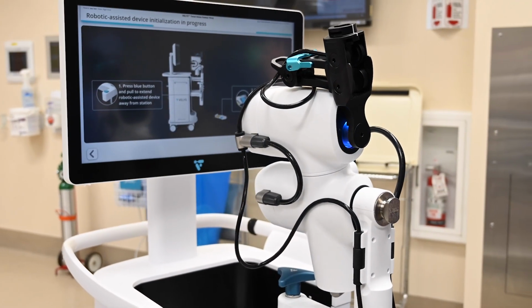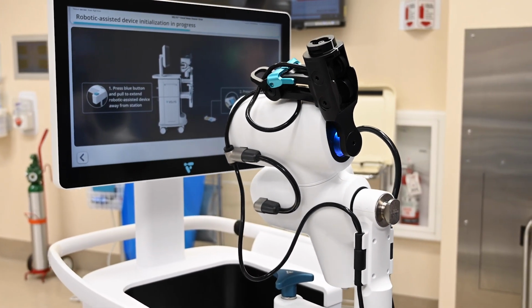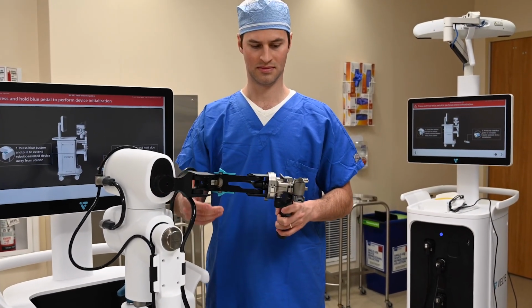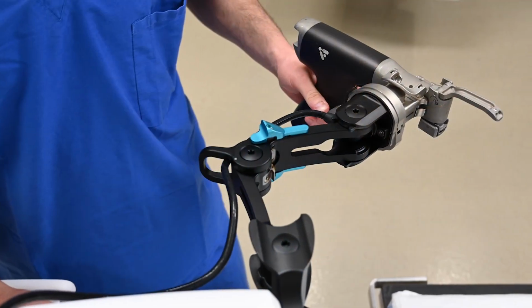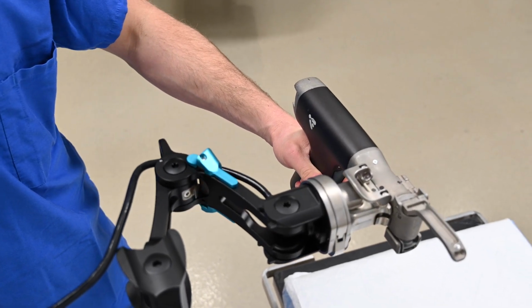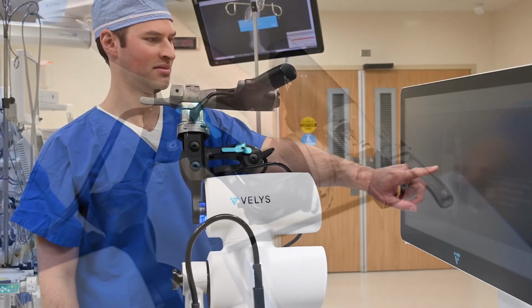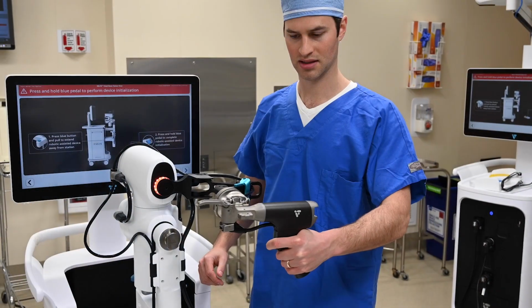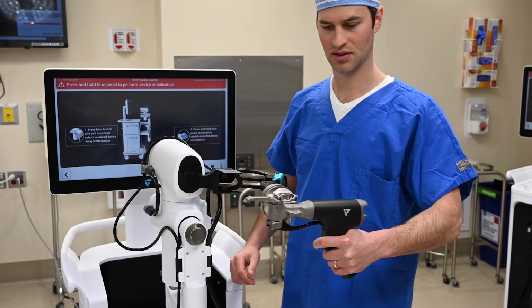Robotic knee replacement has been a technological advancement over the last several years, which has allowed us to improve the accuracy and outcomes of knee replacement. During robotic knee surgery, the patient's knee anatomy and alignment is mapped and registered with a robot. We then have a planning screen where we're able to make small fine-tune adjustments in where the components are going to go into the knee to provide a personalized and tailored approach to each individual patient's knee replacement.